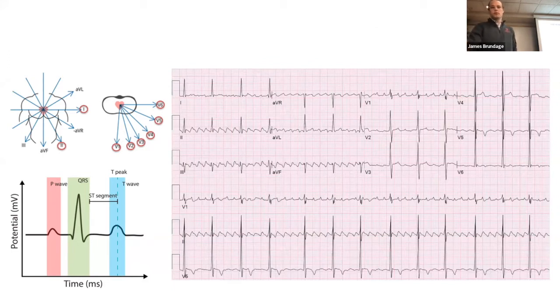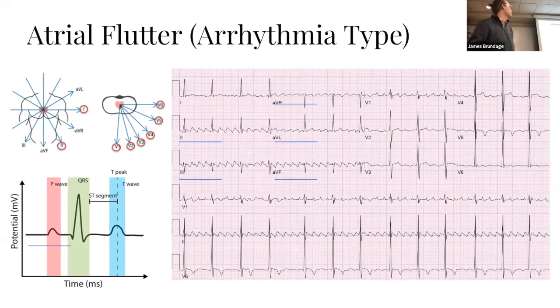And so looking forward, we can look at other ECGs where, once again, from baseline, this kind of sawtooth pattern really jumps out at the beginning and seems quite obvious. And this is an example of an arrhythmia called atrial flutter. But once again, it kind of jumps off the page.